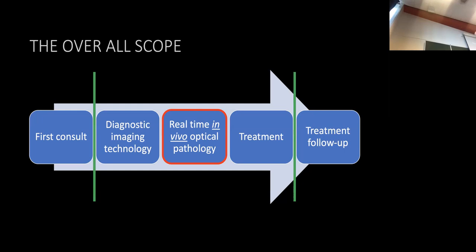If you have a technology, any optical technology, that is real time and gives you the diagnosis right away, you're basically in business. Because then, if you know what it is, you can discuss with the patient: okay, we already brought in some needles with an optical technology. We're already there. This is what we believe that you have with a certainty of this high, and we can treat it right away. Are you okay with that? And we know by now that a lot of patients would like that.